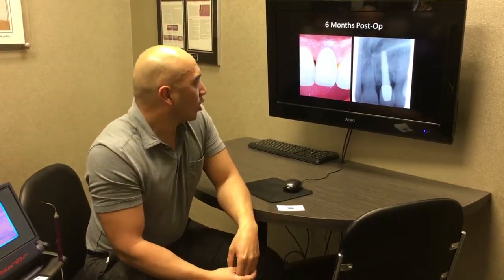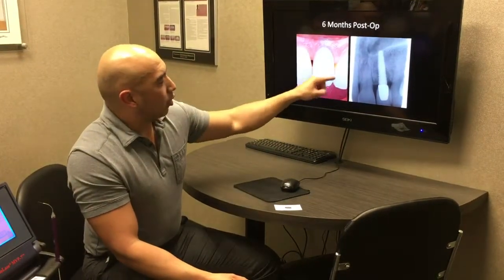More importantly too, for those of our dentist friends that are watching this video, we can actually get the bone to grow back without causing the gums to recede, which is a really common problem when you're working around dental implants that have bone loss.